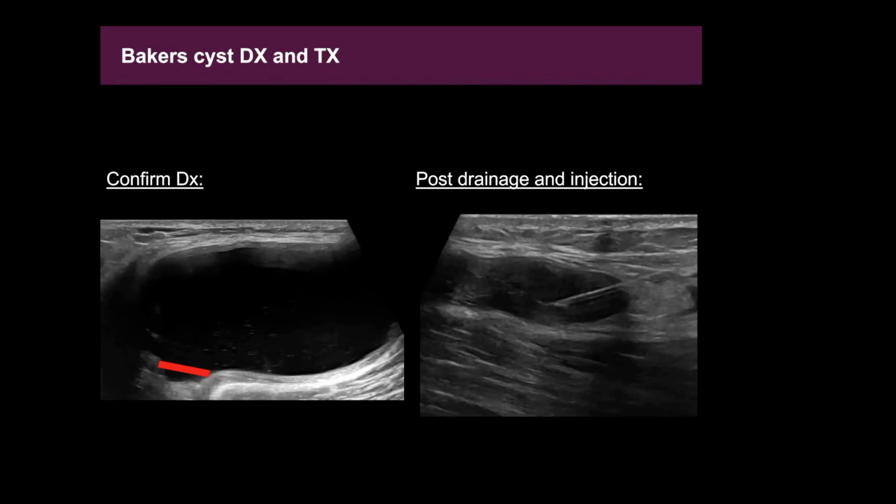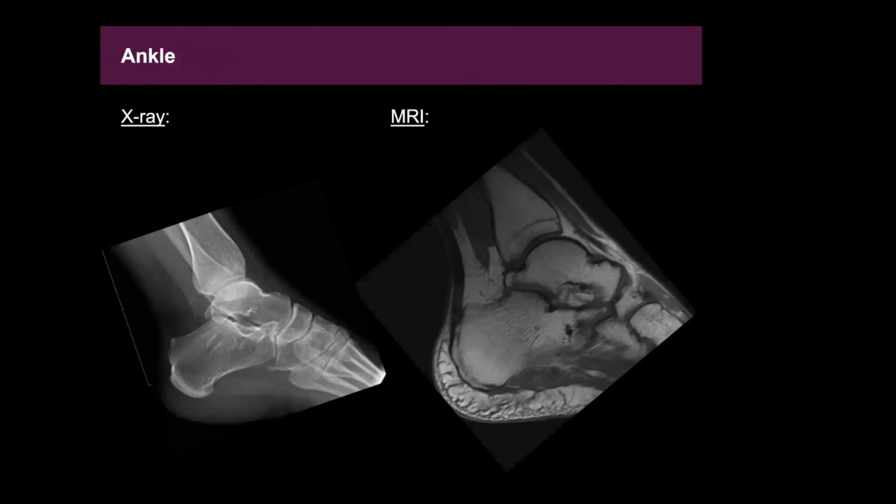And as long as you could confirm that diagnosis, you could certainly aspirate it and inject it with some steroids and some anesthetic to provide the patient some relief. Okay, so ankle x-ray.